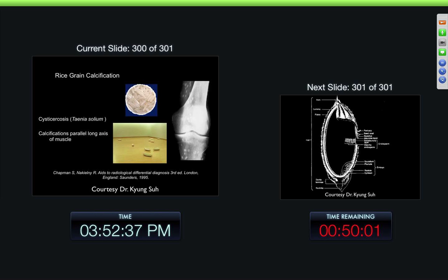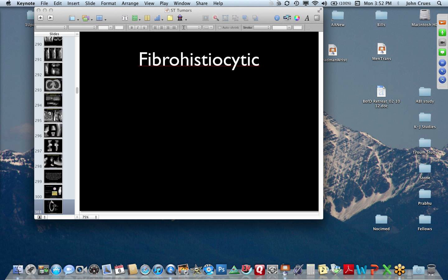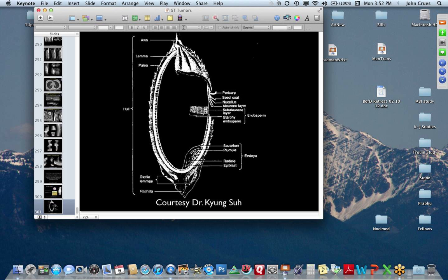Here, a young woman with joint stiffness — here we can see all these calcifications within the muscle, all over the place. And this is cysticercosis — they are like little rice grains. So that's really an overview of soft tissue masses.